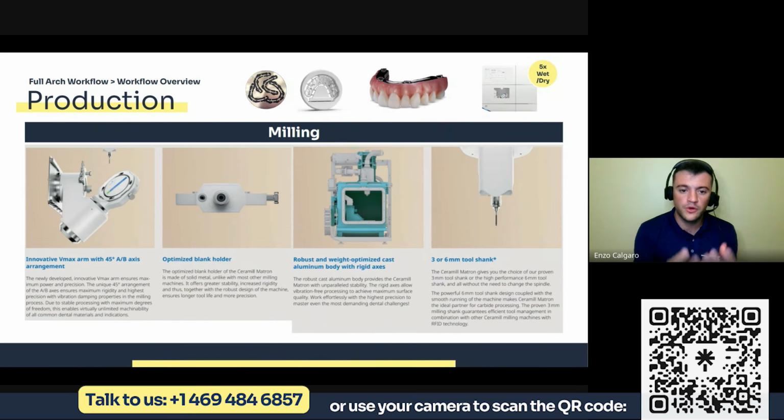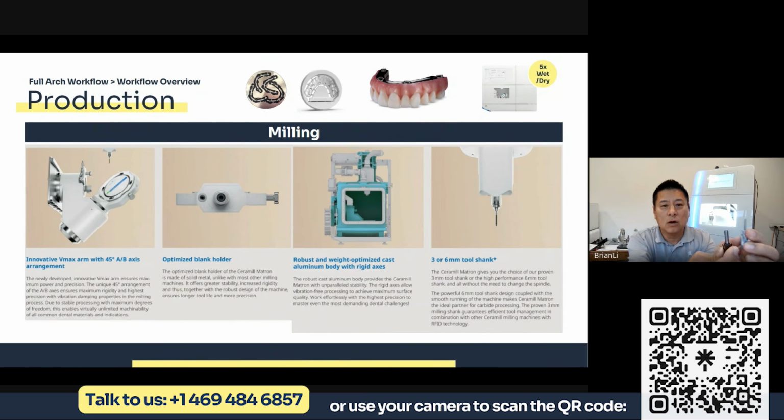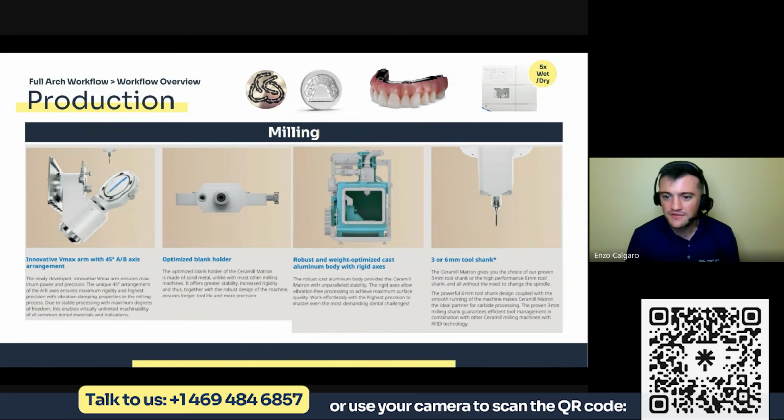This is the whole point of when you're buying a mill that is able to do metal, you have to be able to control vibration. There it is. Brian has it on the screen. Brian, I think you have to speak to be able to pop up on the screen. Oh, okay. So these are the 2 different shanks, 3 millimeter and a 6 millimeter for milling metal. Yeah. So we don't have to be mechanical engineers or anything just to realize that thicker means more stable, thinner means less stable. So that's why you need thicker burrs when you're milling titanium.